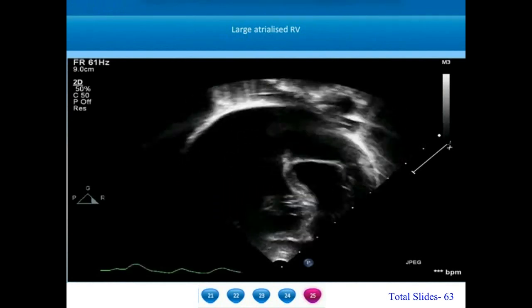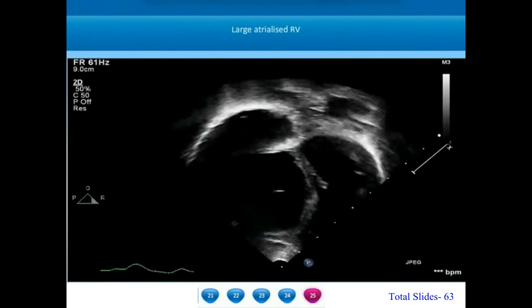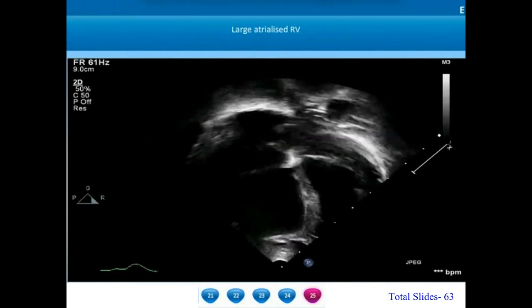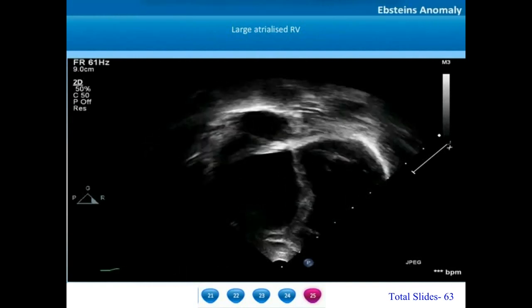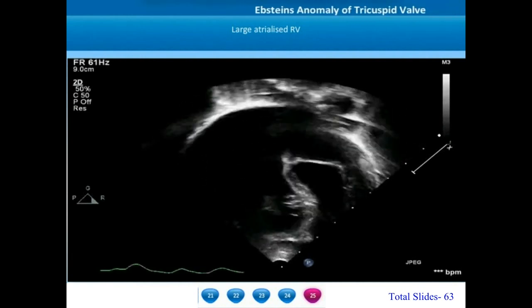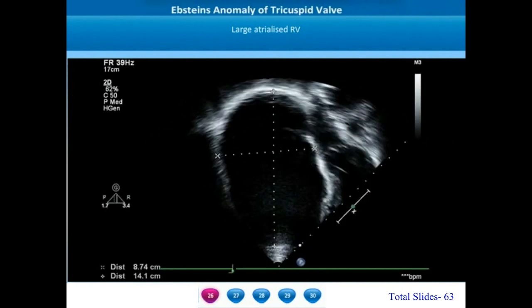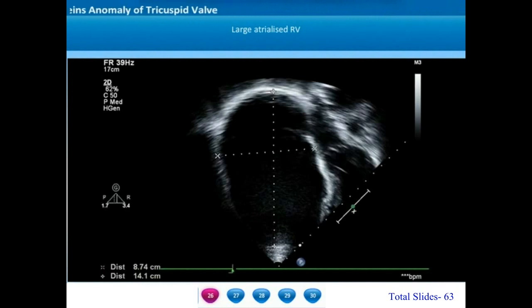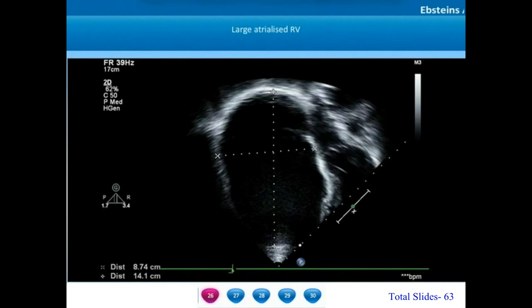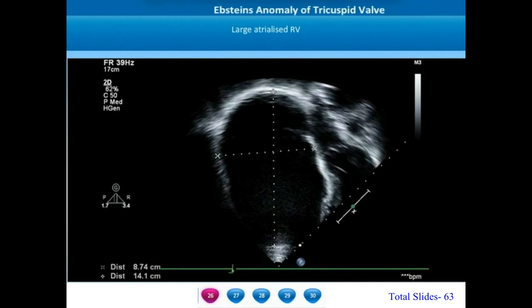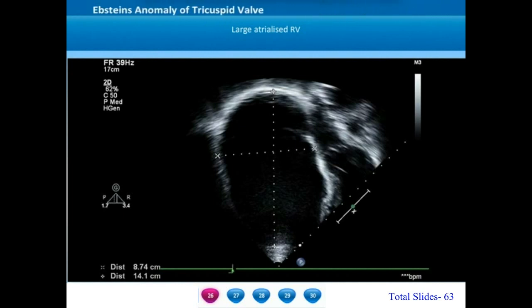Another example of Carpentier type D Epstein's anomaly shows total plastering of all the leaflets to the right ventricular free wall. The atrialized portion of the right ventricle is markedly dilated and aneurysmal. The area of the right atrium and the atrialized right ventricle will be much larger than the combined area of the left atrium and left ventricle.